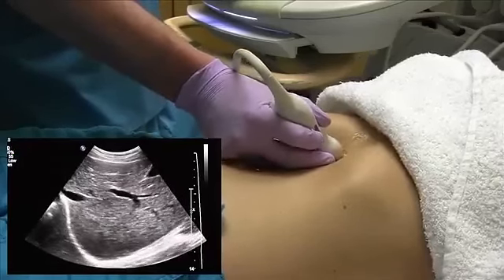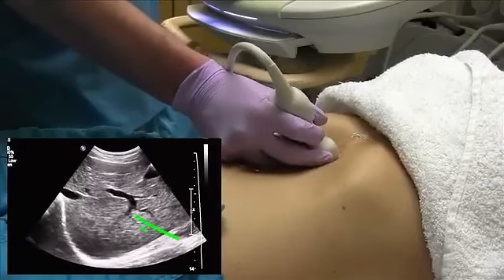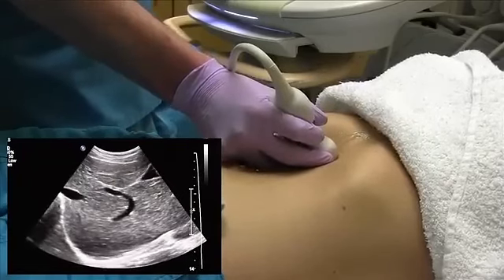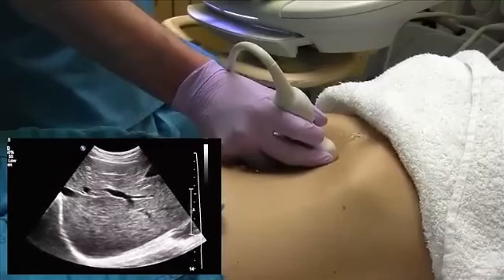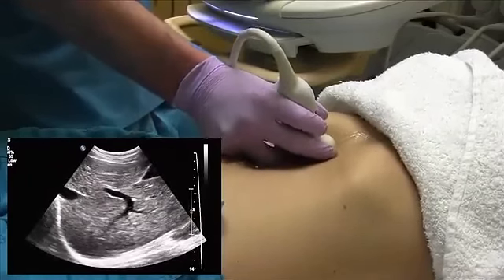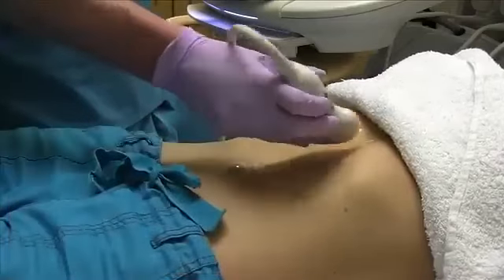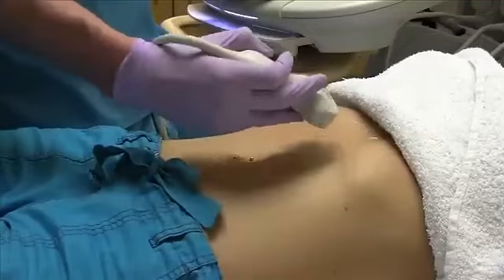The third picture of the right lobe you're going to take with the portal veins. If you were looking for any ductal dilatation, this is where you would see that at the level of the portal system. And from there you just sweep all the way out of the liver. So that's the sagittal sweep through the liver.